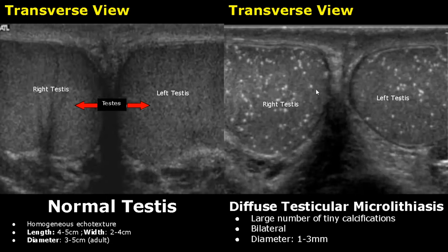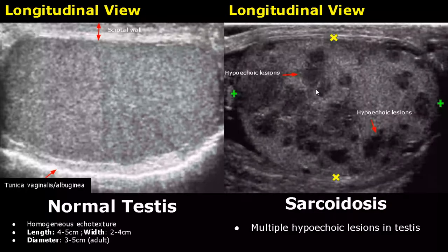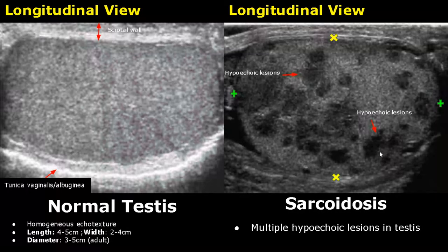In the case of testicular sarcoidosis, the testis contains multiple hypoechoic structures spread throughout the organ.